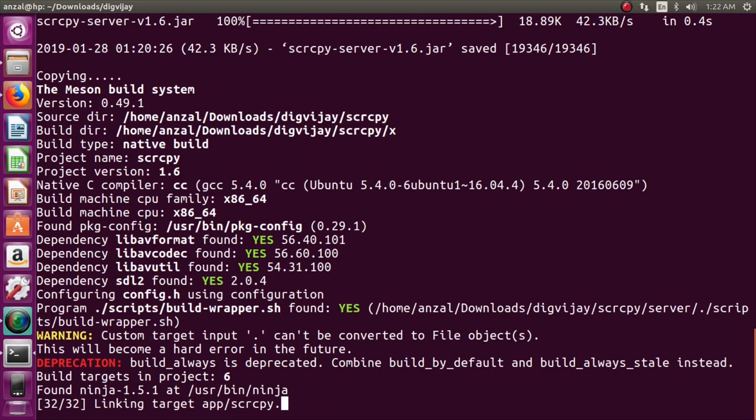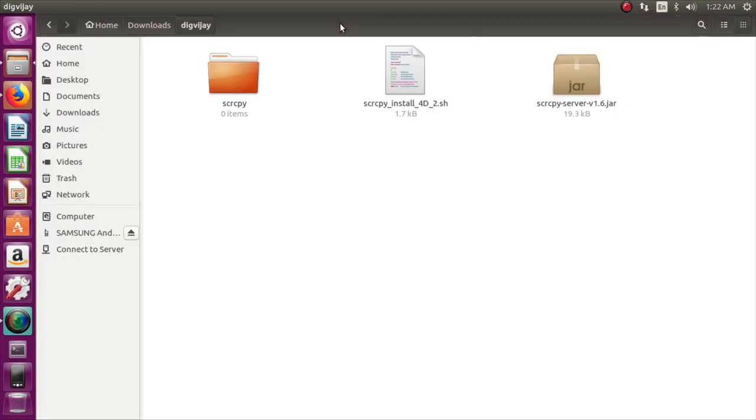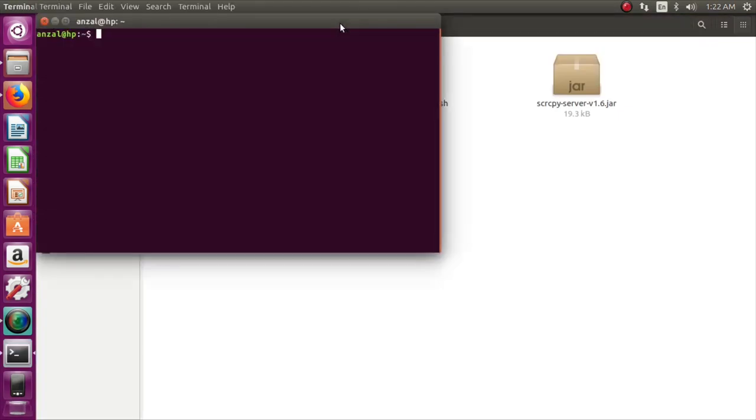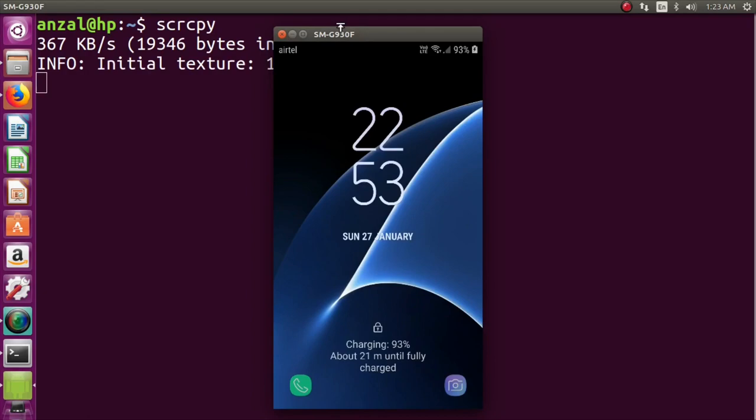And yeah, so once installed, just open a new terminal and just type scrcpy after connecting your phone. Make sure the developer mode is on, and as you can see, the phone connects.